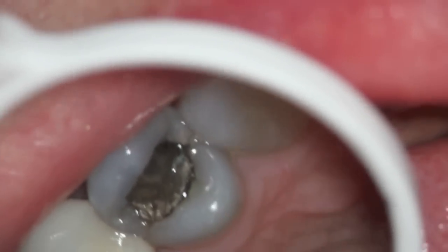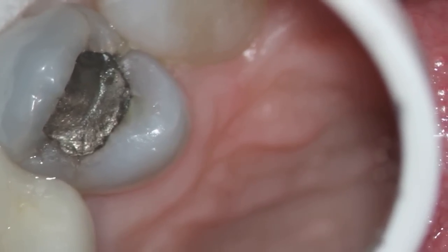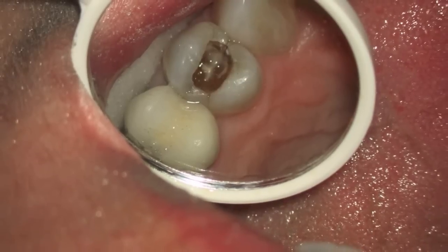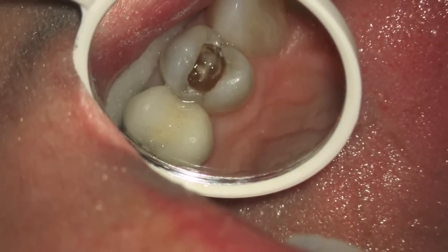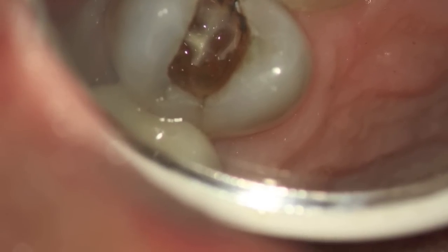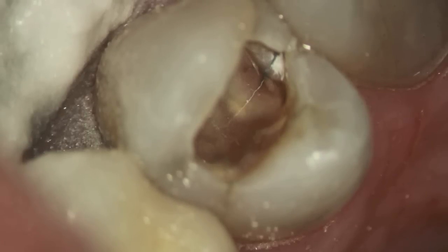This is an exercise for someone to learn to use the microscope a little bit better. We took a filling in the upper left arch — an old silver filling that had been in for 17 years. We removed it, and there's a crack underneath the filling. We know that it's going to later on need a crown or an onlay.